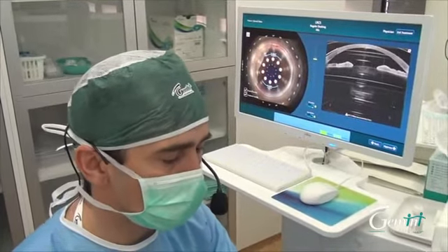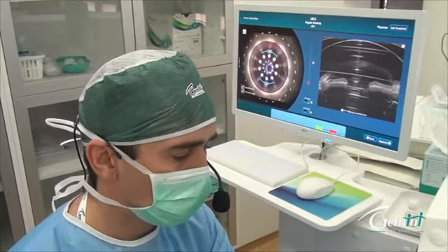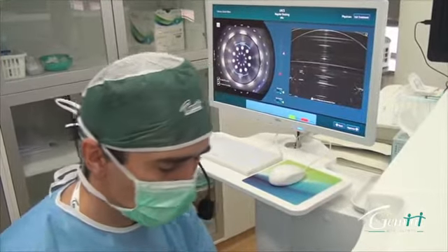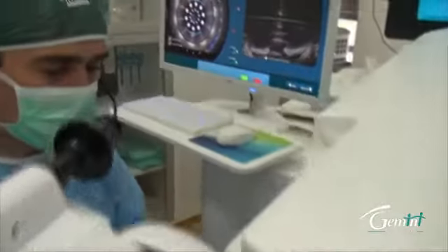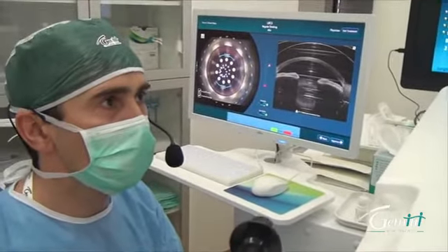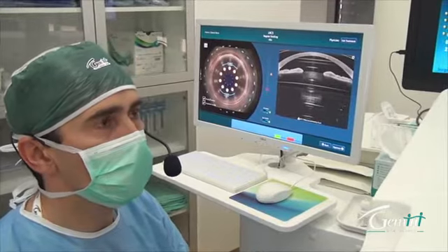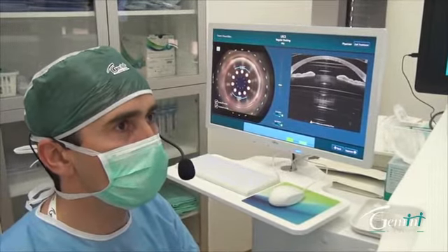I still believe we need a drop to equalize that. So we put one more drop to the interface, and then we come once again with the patient towards the interface to get the best possible contact, and the eye is coming towards the interface of the laser, and we are getting perfect contact this time.